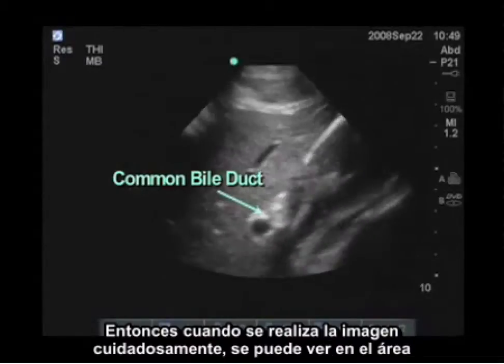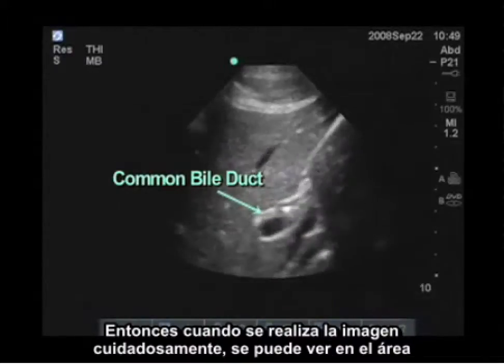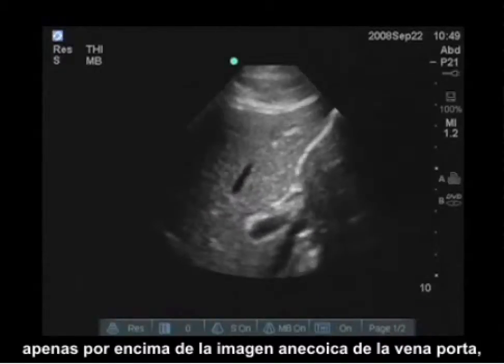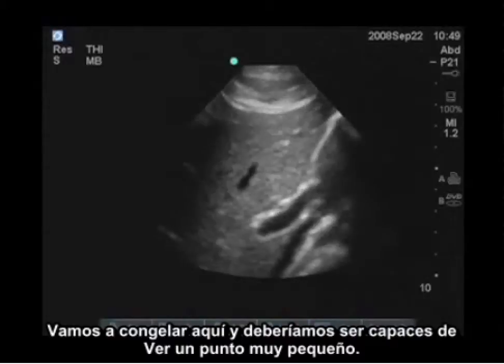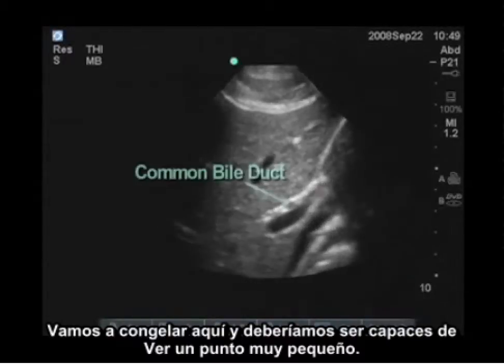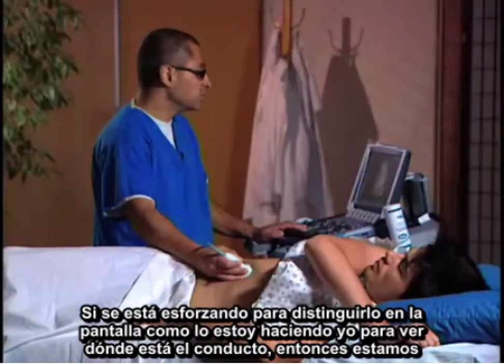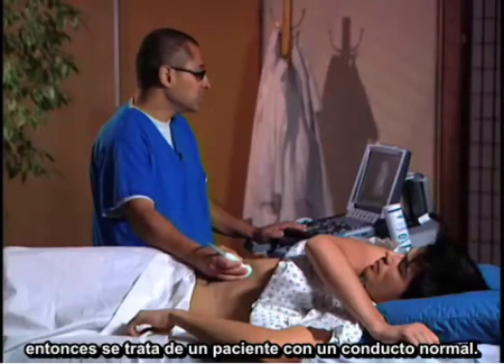When we carefully scan, you can see an area just above the portal vein which is anechoic. I'm going to freeze this in a moment and you should be able to see a very tiny duct. If you're squinting at the screen trying to see where the duct is, you're dealing with a patient with a normal duct.